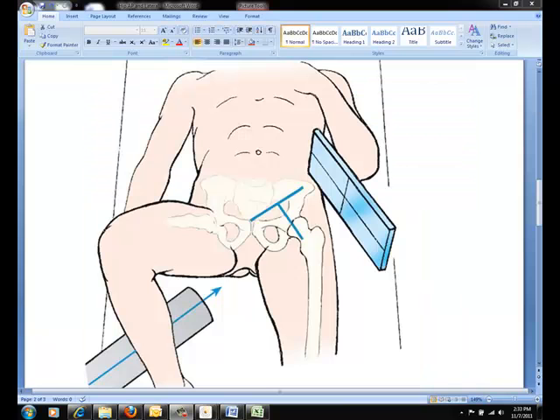When positioning the IR, place the IR in the vertical position with its uppermost border at the level of the crest. Angle the lower border away from the body until the IR is exactly parallel with the long axis of the femoral neck. Then direct the central ray perpendicular to the long axis of the femoral neck.